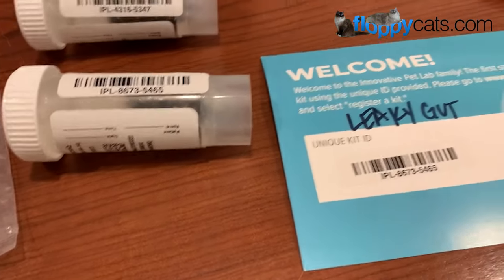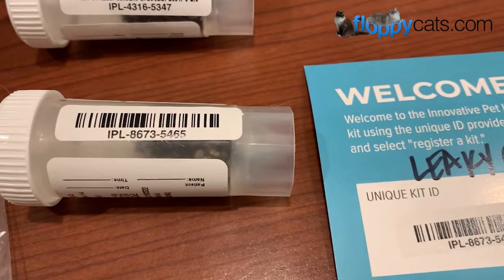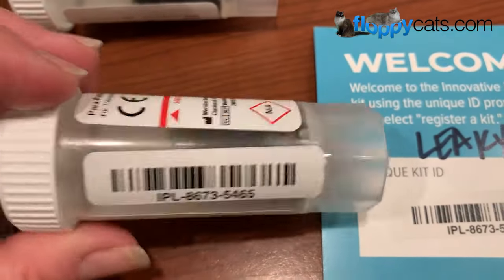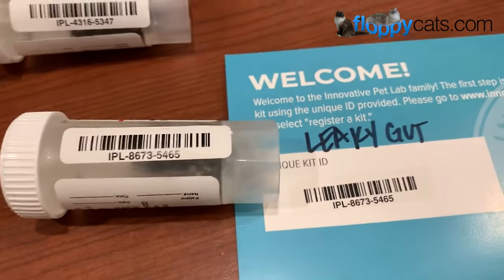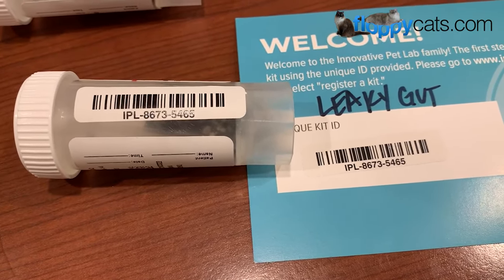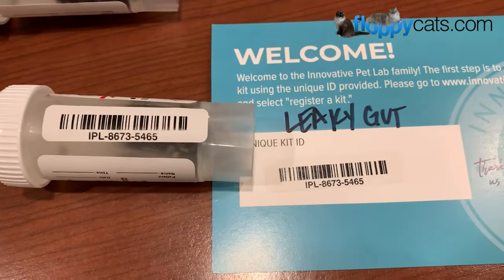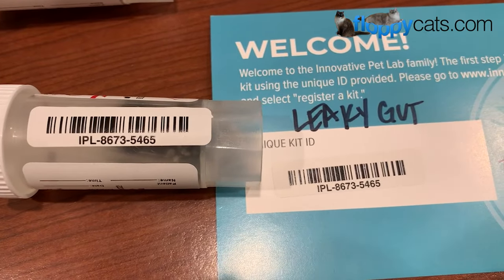In all my excitement, I got both kits mixed up, so I just wanted to show you how to identify them. I registered online, and ID number 5465 told me it was the leaky gut kit. And on the side of the tube, it is also labeled 5465. The reason I got so excited is because when you have two cats, it's really hard to catch them pooping and make sure it's that specific cat's poop. I'd been waiting about a week to catch Charlie pooping, and I finally did — so I ran and got my kits. That's a quick way to know which kit you have.